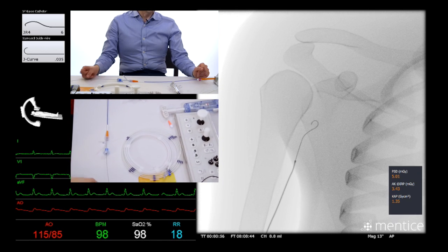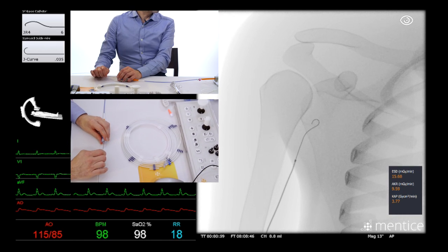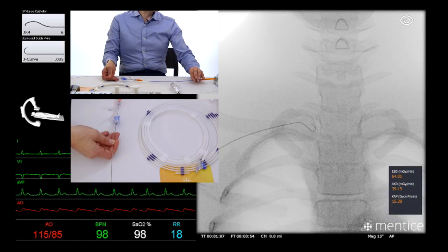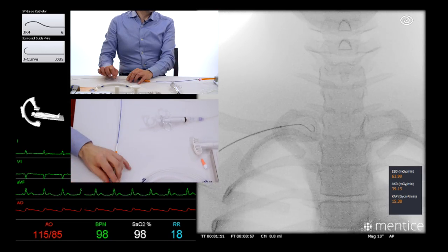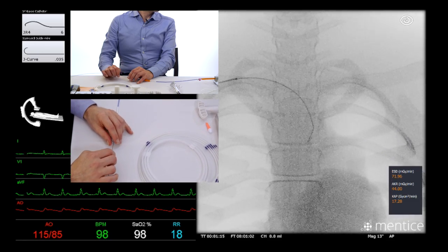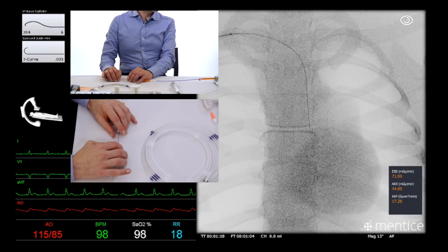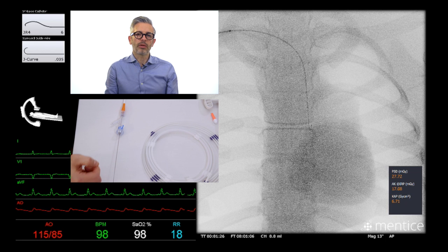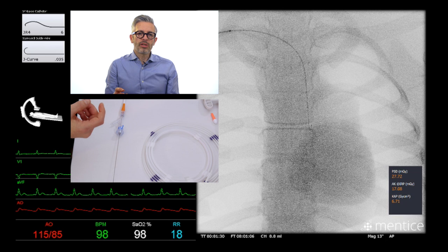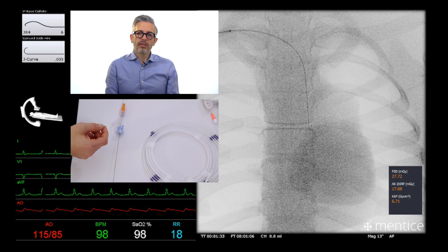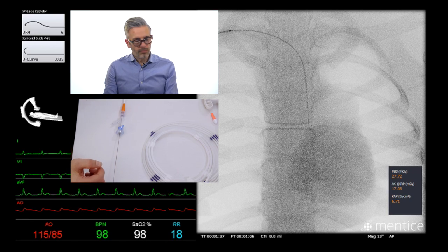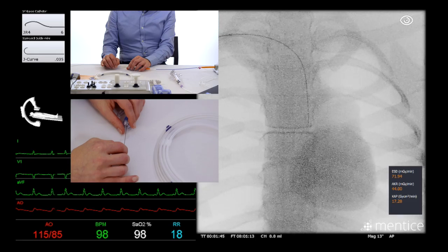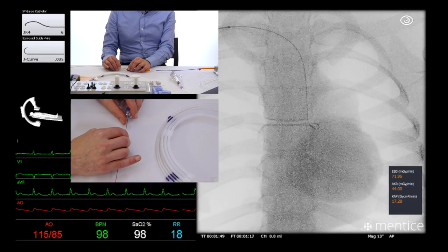This is us navigating up through the radial artery approaching the brachial artery and that went very smoothly through the elbow. That can commonly be a place where you might find yourself entering some small branches which requires you to redirect your wire or sometimes take an angiogram to understand the anatomy. Continuing up the brachial artery now, I've got a good amount of wire in. I'm going to advance my guide catheter over the tip of the wire, fixing my guide wire and slowly advancing my catheter, but not letting the tip go past the end of the guide wire. As I advance my 035 wire you'll see it comes and abuts on the aortic valve.